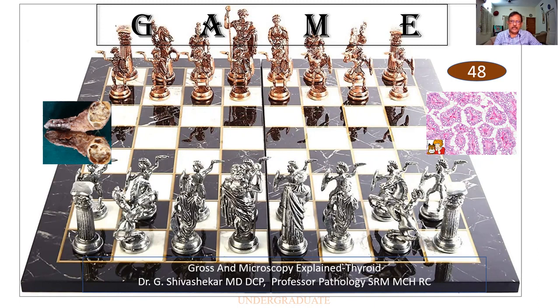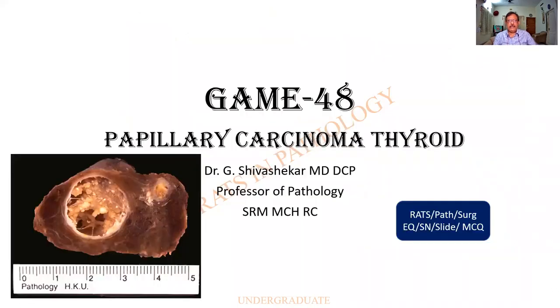Dear students, I hope you remember GAME. What is GAME? Gross and microscopy explained. And since we are towards the end of systemic pathology, thyroid is important. We shall go to one particular lesion, namely the papillary carcinoma of thyroid.